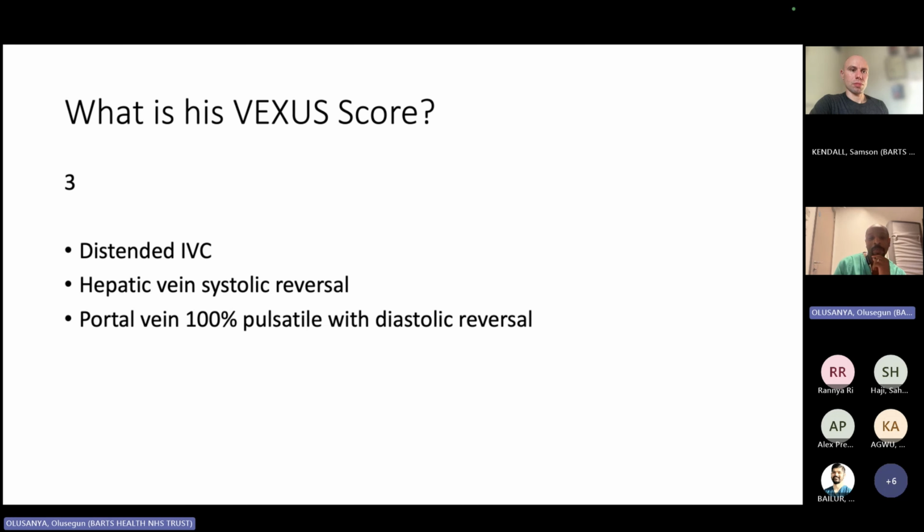So again, this is interesting. What's going on? You've got all these papers out there, including myself, 4 years ago, talking about VExUS as a volume state monitor, but it's not really doing that, and it's not really correlating with acute kidney injury.